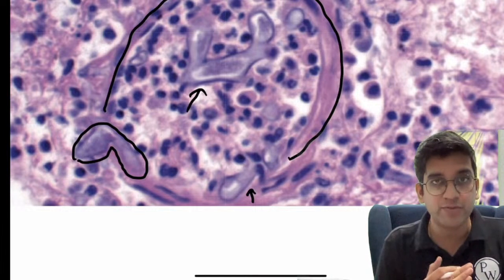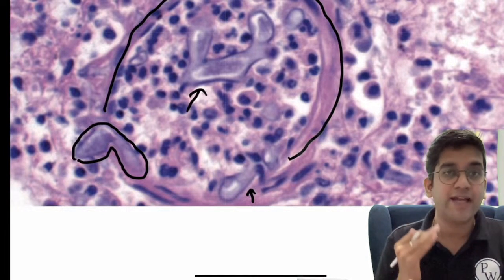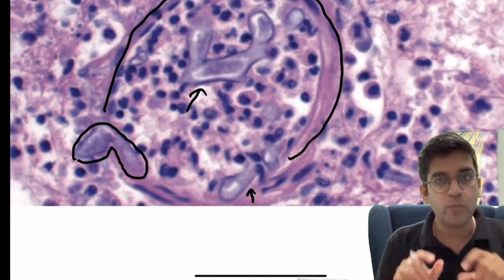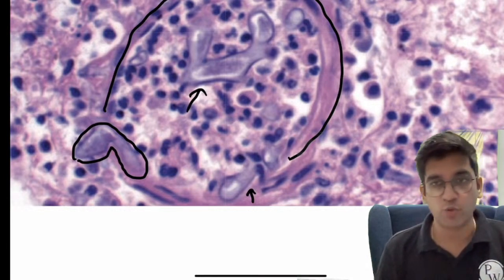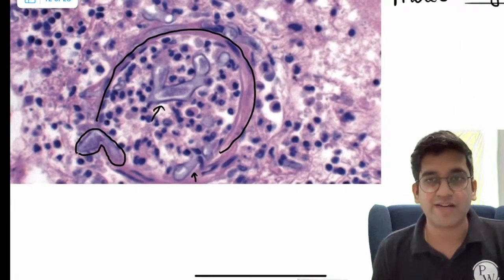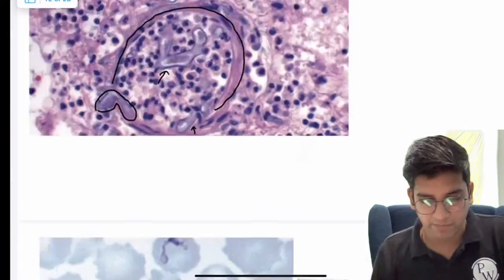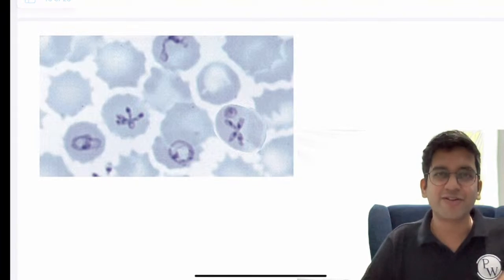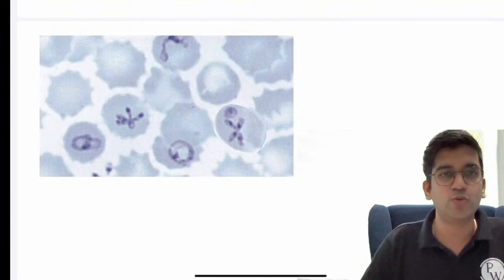It's angio-invasiveness, which makes it very, very deadly. It's definitely an emergency to report. Right-angle hyphae with bulbous ends are classical for mucormycosis, right? COVID, yeah, black fungus came with the COVID thing, right? Perfect. Now, spotter. This has not been asked, since we are going with few PYQs, but it could come if something new comes in.